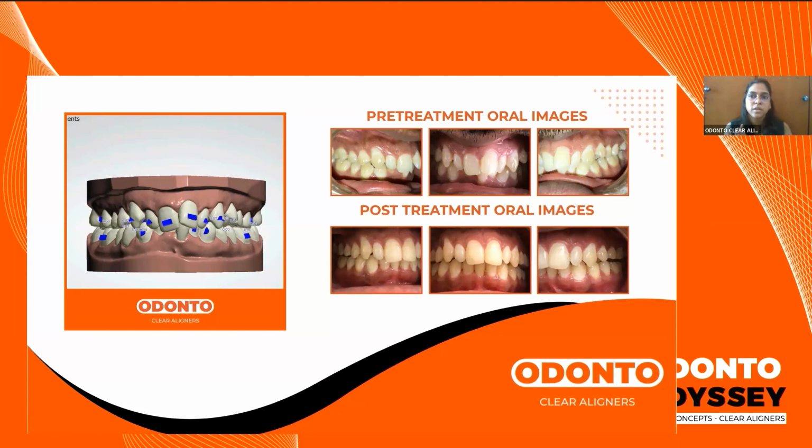We do not do this buildup in the middle of the treatment because that would then have us asking to reboot the case, in which you have to send in a new scan or set of impressions in case there is any change in the tooth structure. That is why we will leave the adequate space for you, and then you can progress to the end of the treatment, at which point you can do either a veneer or a composite buildup.